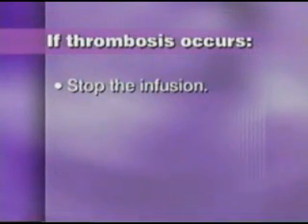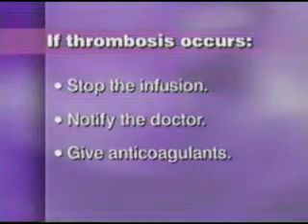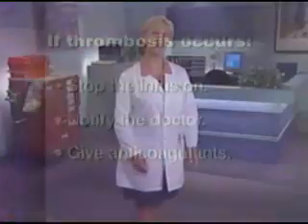If thrombosis occurs, stop the infusion, notify the patient's doctor immediately, and give anticoagulants as ordered. If the clot is in the lumen of the catheter, you may need to instill a thrombolytic to dissolve it. Follow your facility's policy.